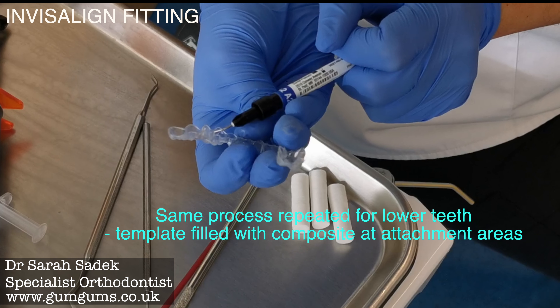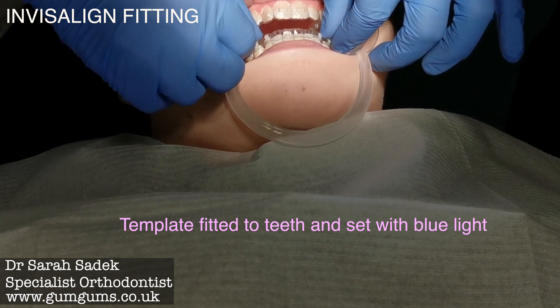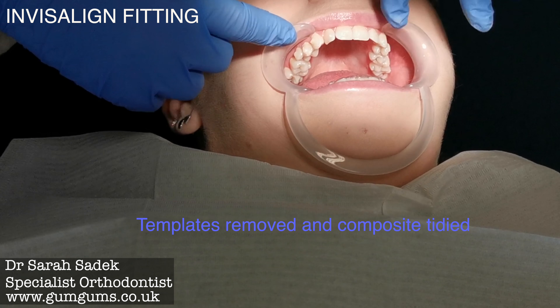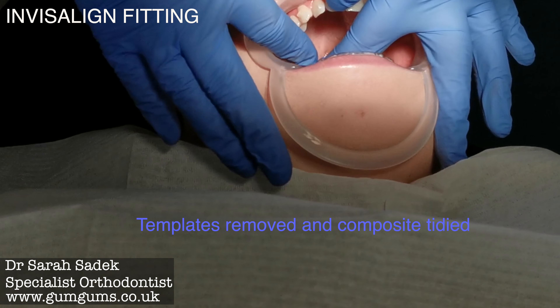The same process is repeated for your lower teeth. Composite is placed into the attachment template, and the template is once again fitted to your teeth. The composite is set with the blue LED light. The templates are then removed with the attachments adhered onto your teeth. The attachments are then tidied up and any excess cement is removed.